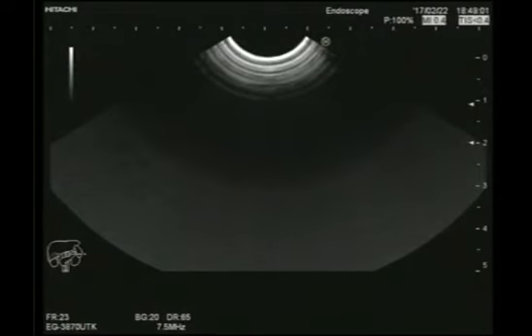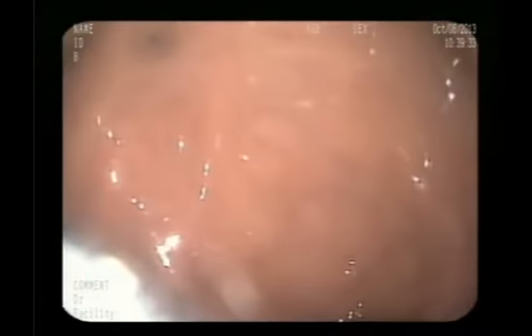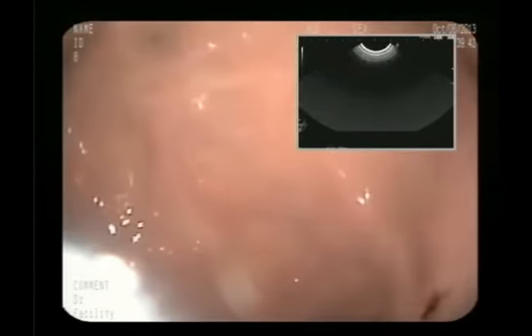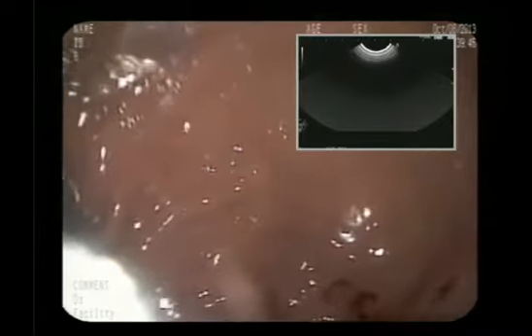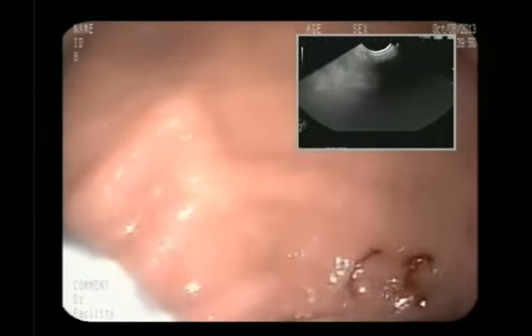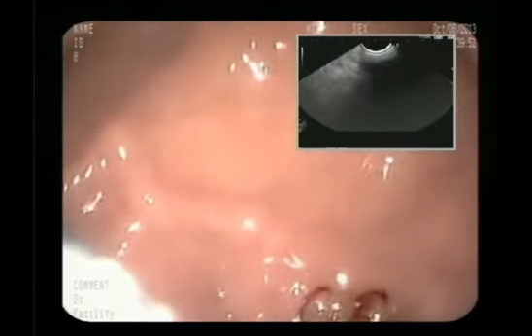In this patient, we are performing EUS for the purpose of staging the tumor and to delineate whether this is a good candidate for endoscopic papillectomy, which is becoming quite popular, and whether this patient is actually a candidate for surgical treatment, the so-called Whipple procedure.